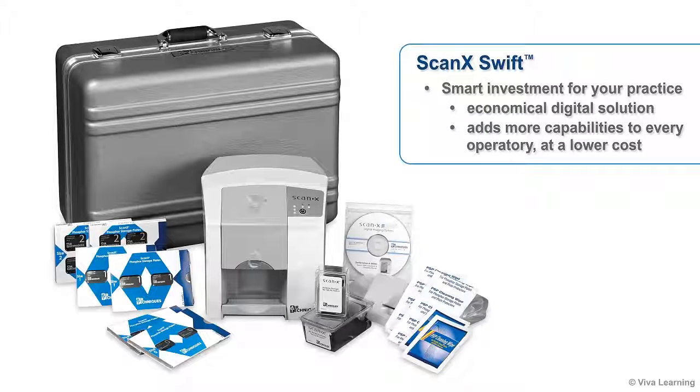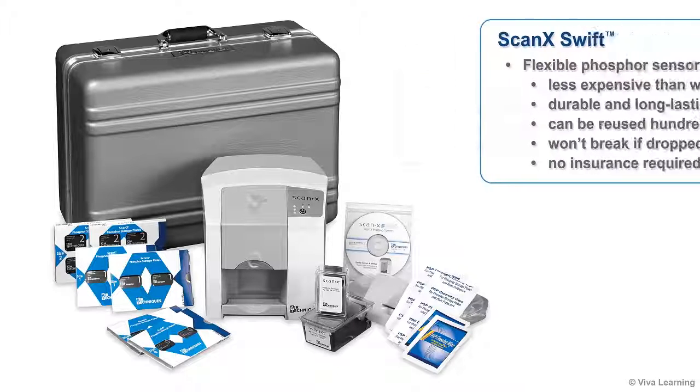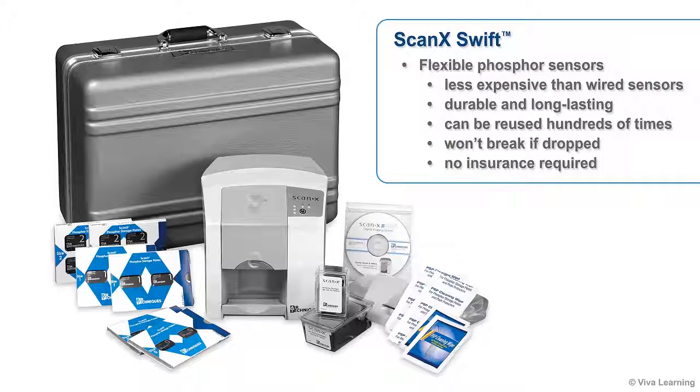There are many reasons why ScanX Swift is a smart investment for your practice. The most economical digital solution for any practice, Swift adds more capabilities to every operatory at a lower cost. Its flexible phosphor sensors are not only less expensive than wired sensors, they're also durable and long-lasting, and can be reused hundreds of times. And because the sensors won't break if dropped, there's no insurance required.